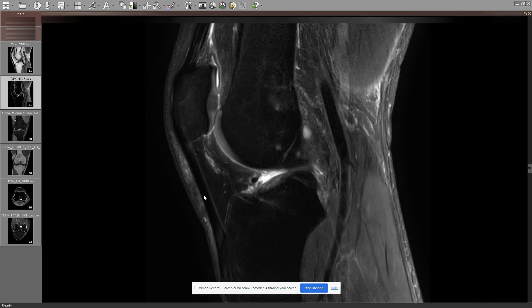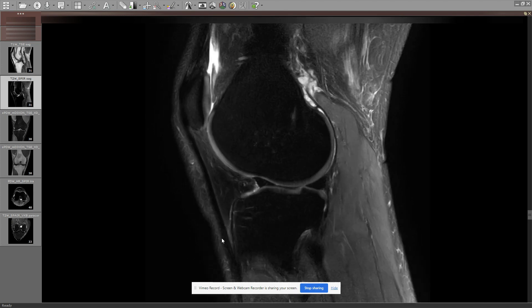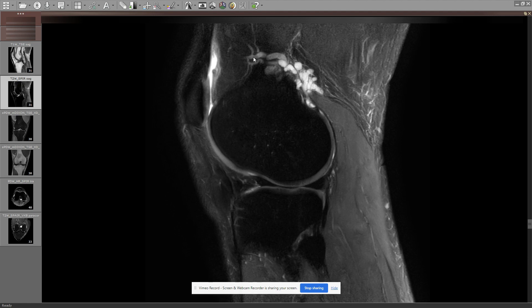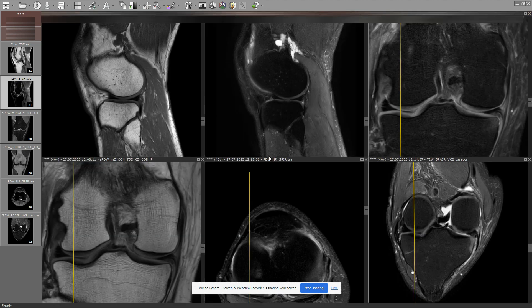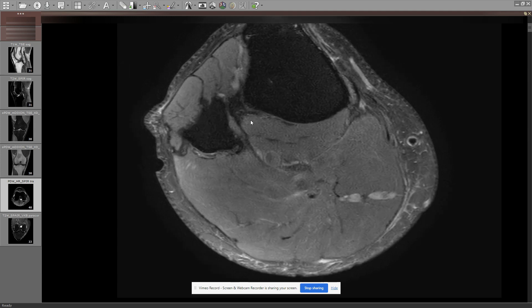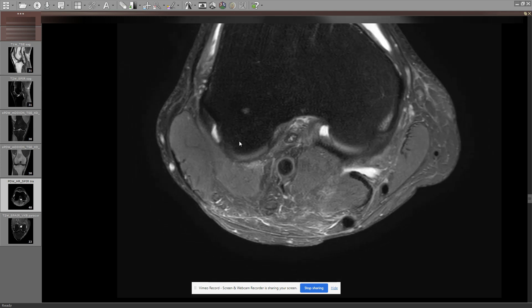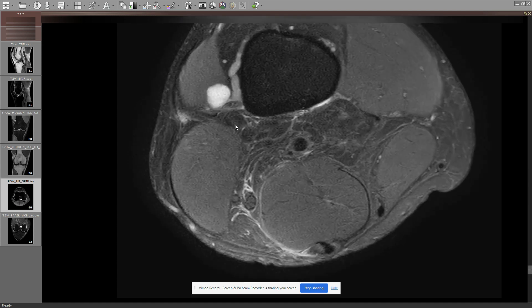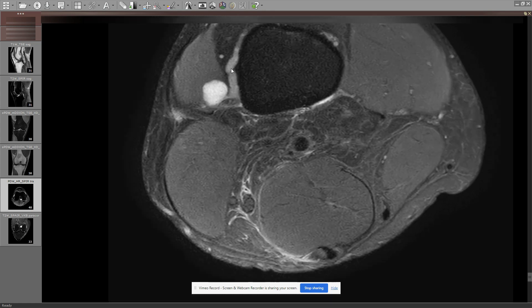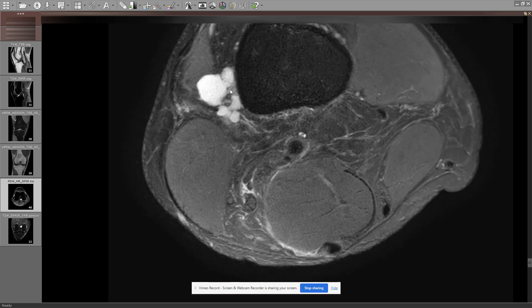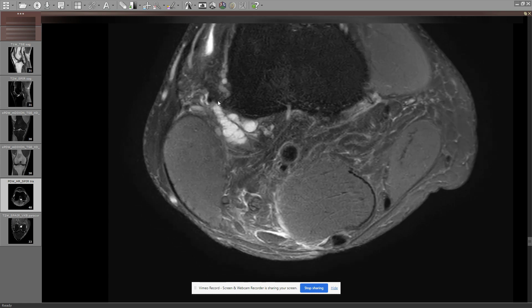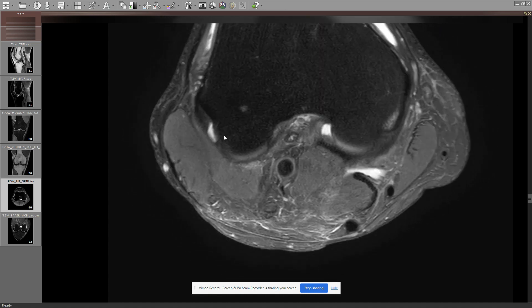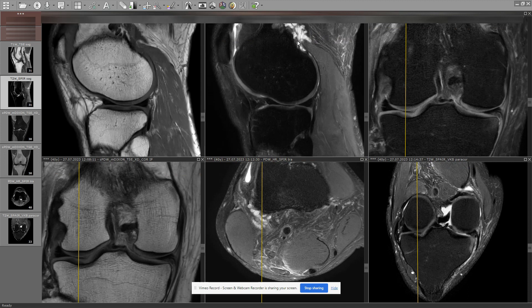The extensor tendons are fine too. Technically, maybe we could go for some tendinosis down there, but it doesn't matter. Then there's something I saw at the very last moment — technically it could also be a vein, like a vascular complex. But it has more the appearance of a ganglion cyst. The vein has a bit of a lower, more dirty signal and it's not going into it quite like this. I think the veins just pass it, and I would still favor a ganglion cyst coming out of the origin of the lateral gastrocnemius tendon insertion.